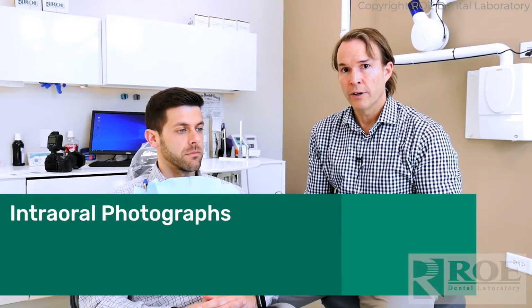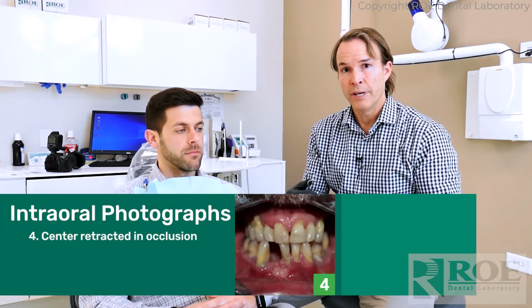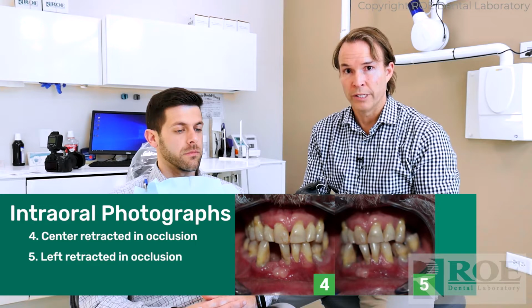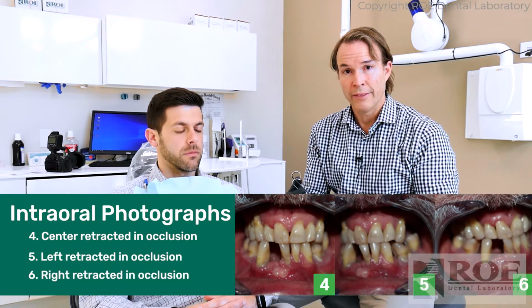The next 3 photographs are the intraoral shots. And with intraoral, we want to capture them with the lips retracted and the patient in occlusion, in centric occlusion. Now, if a patient has a partial denture that's holding them open, and that's the bite we're going to use, then capture the photographs with the partial seated. The goal of the photographs is that we have nice intraoral shots with a nice depth of field, so that we can match the mounted casts with the photographs to ensure the bite's perfect and the mounting's perfect.